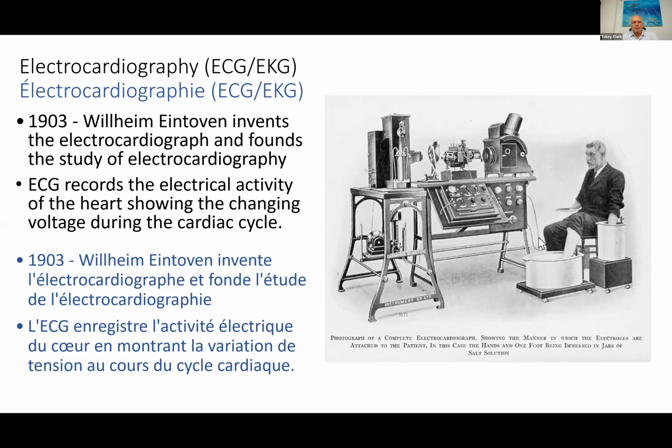There are wires connected to the bucket that goes to the apparatus, which is largely more of a photographic optical system rather than the systems that we use today. So quite complicated, quite innovative. Over.